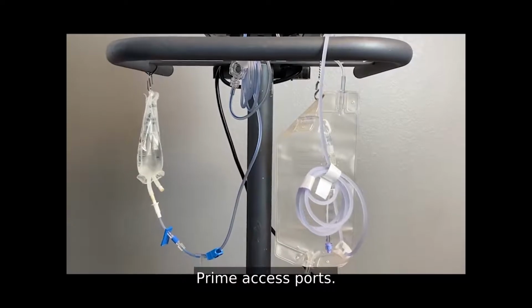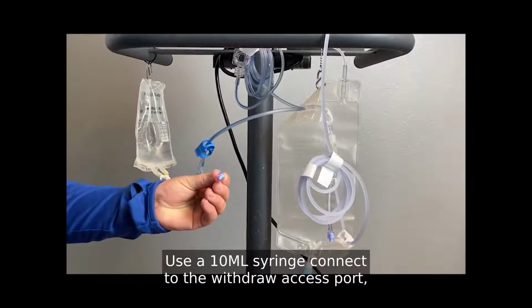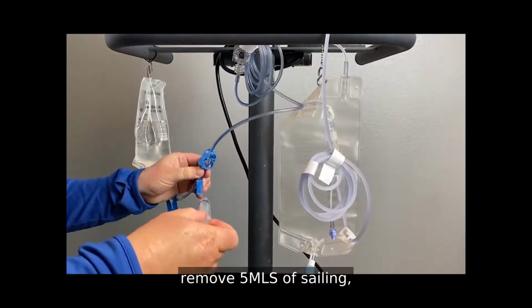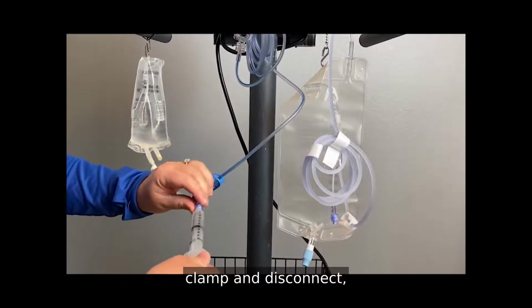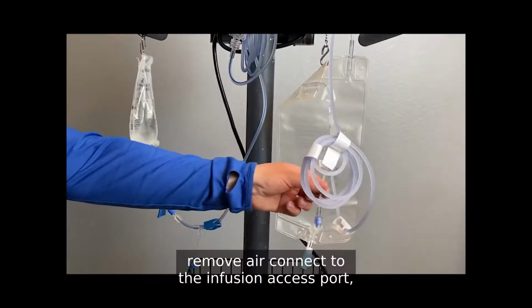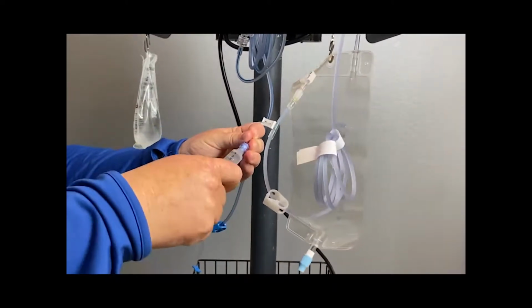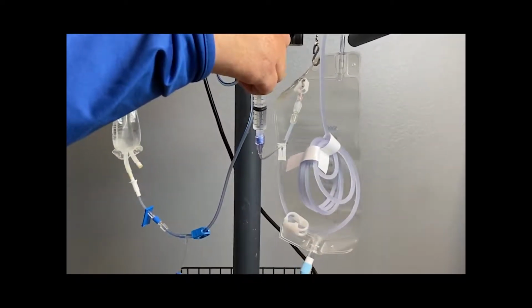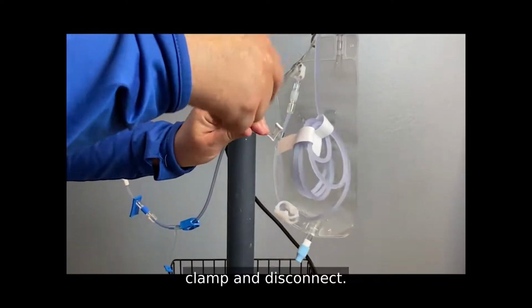Prime access ports. Use a 10 ml syringe. Connect to the withdraw access port. Remove 5 ml of saline. Clamp and disconnect. Remove air. Connect to the infusion access port. Infuse 3 ml. Clamp and disconnect.